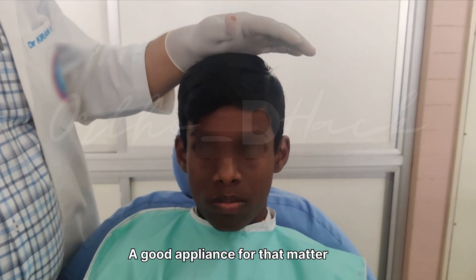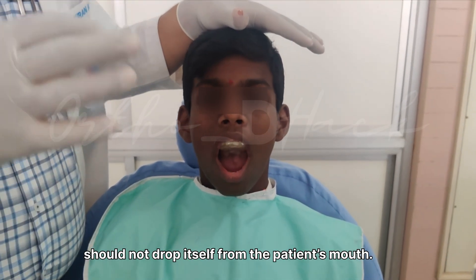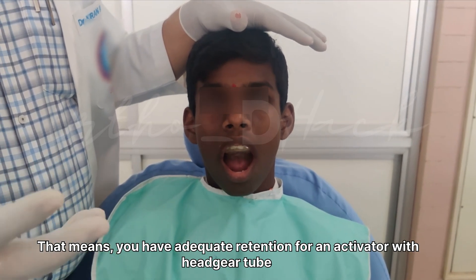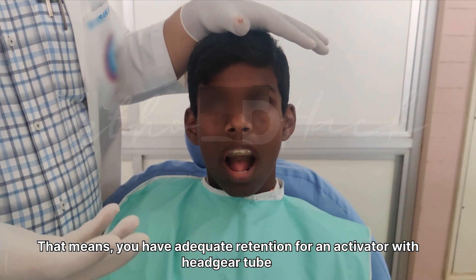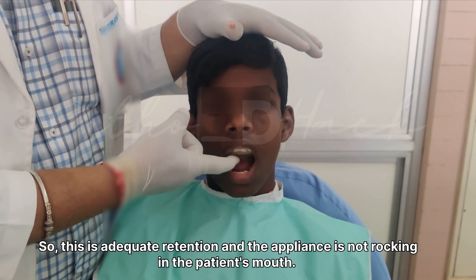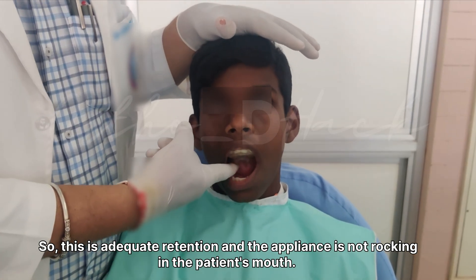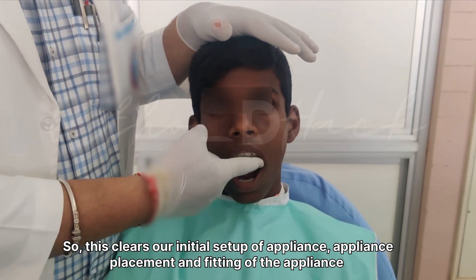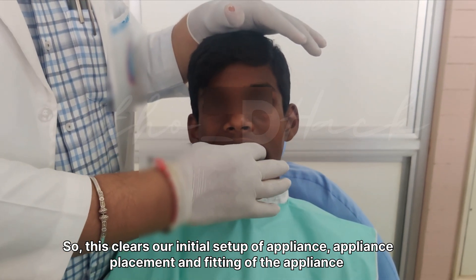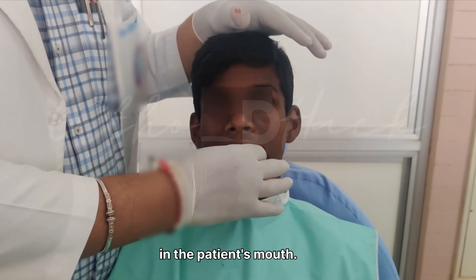A good appliance should not drop out from the patient's mouth. That means you have to achieve adequate retention for the activator with headgear. The appliance should not be rocking in the patient's mouth. This covers our initial setup of appliance placement and fitting of the appliance in the patient's mouth.